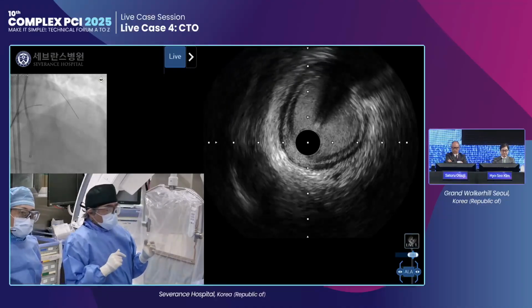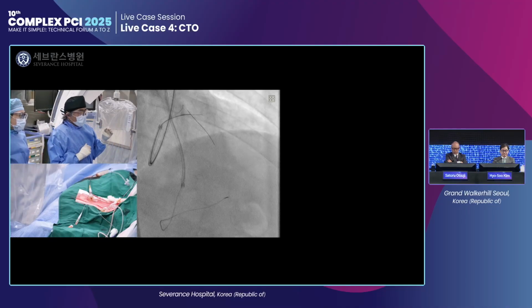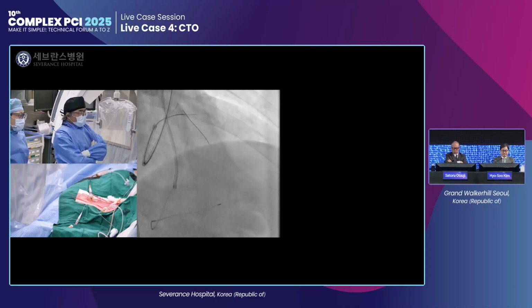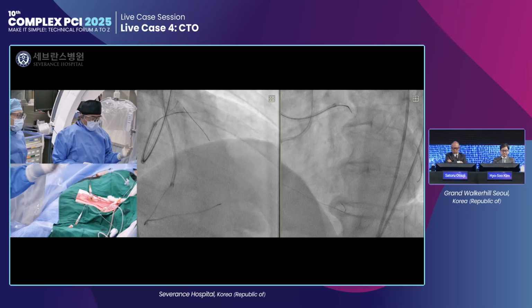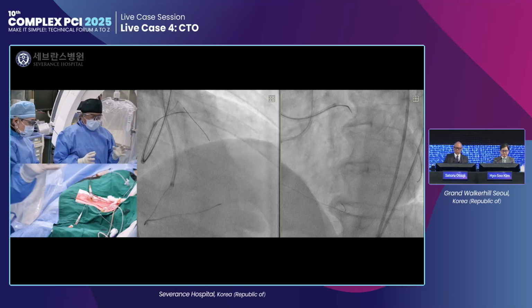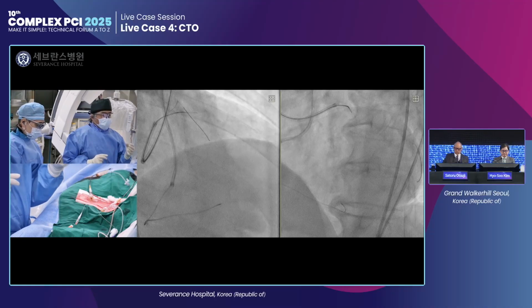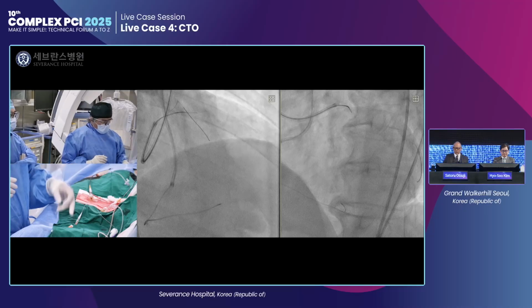So, okay, please show the angiogram. This is the RAO view. And then the previous wire is XTA, and I just stopped the wire movement or advancement at this portion. Well, it's not so bad. So the antegrade wiring escalation. Next, I'm going to use the Gaia. Next one.